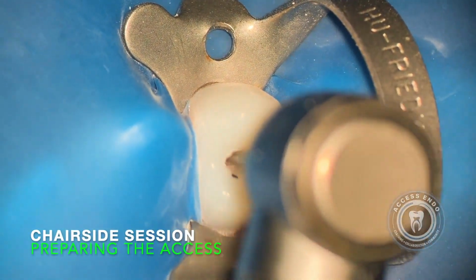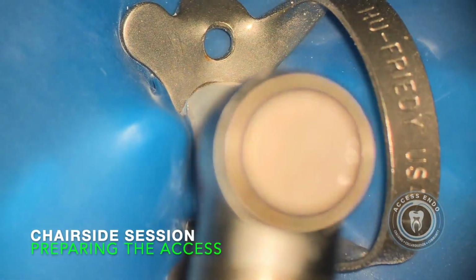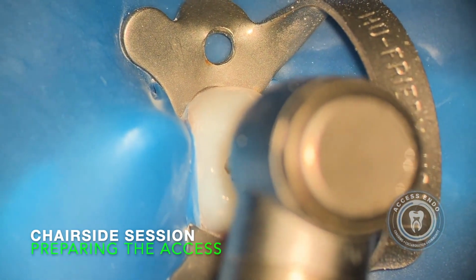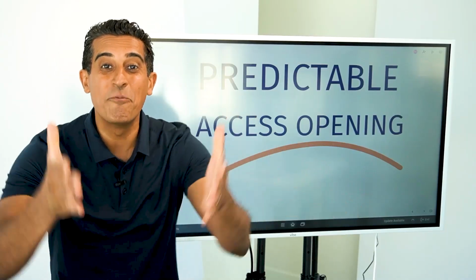So I put my burr in, I can see I'm right down the center, I feel good. I'm not too mesial, not too distal, not too buccal, not too palatal, and so now I'll hit the gas again. Now I'm going to feel, and I'm going to break right into it, and I drop right into the pulp chamber.